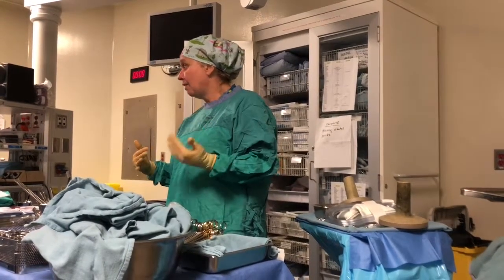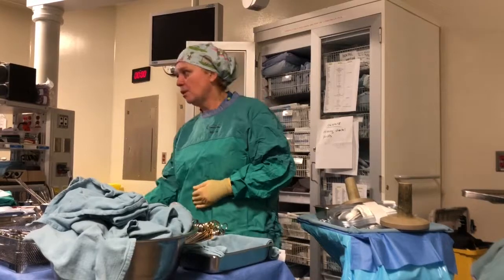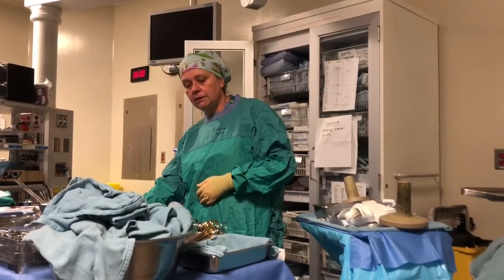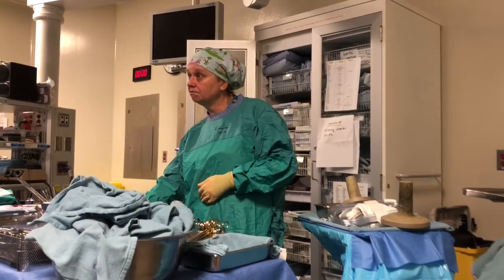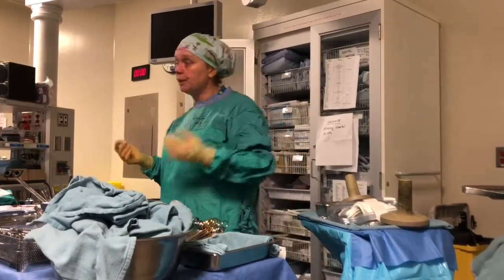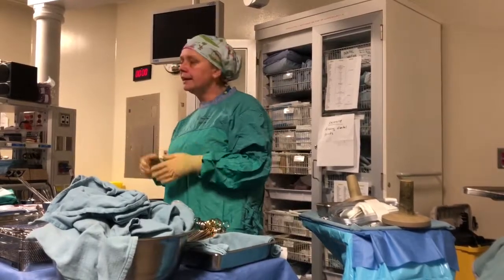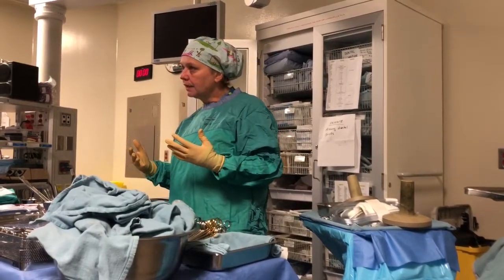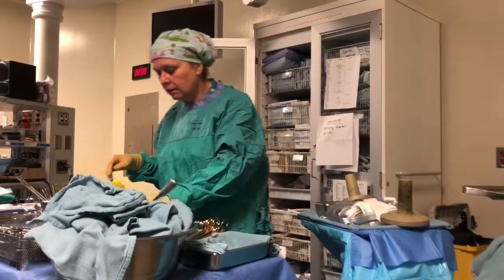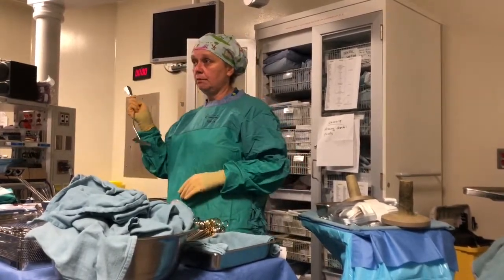It's surprising how they're all kind of the same. They're done pretty well the same, yeah. The only difference is sometimes when they're sewing in the graft, they use different instruments to sew, like needle holders or whatever, their preference. By then it's controlled, right? But as far as, like I said, I have never seen a compression clamp used.